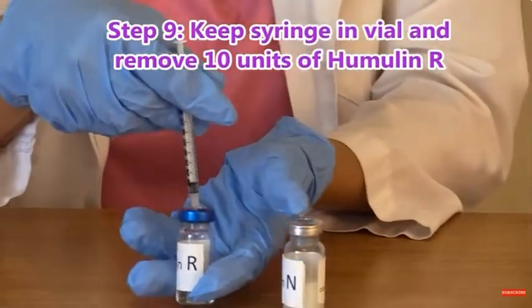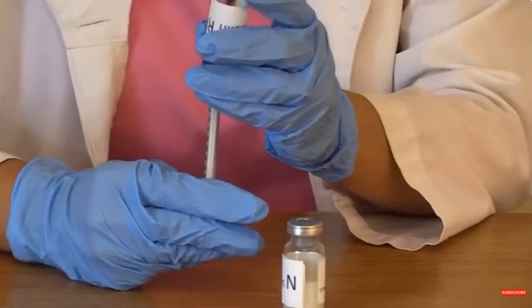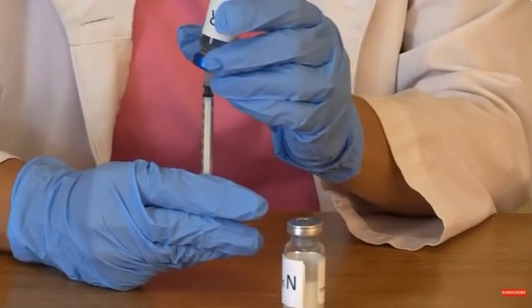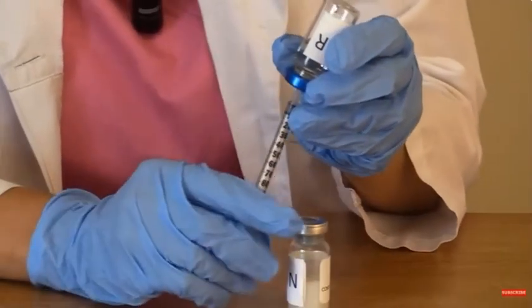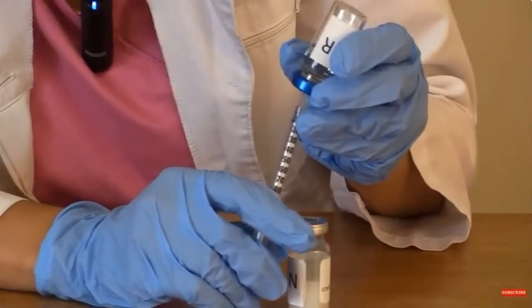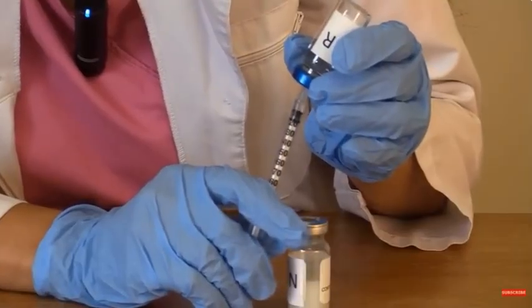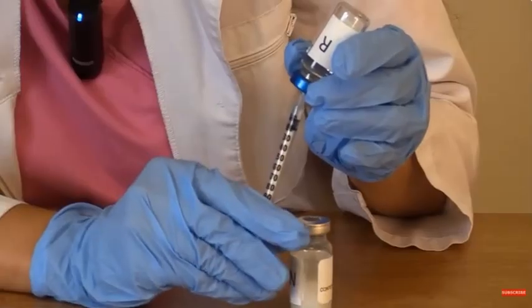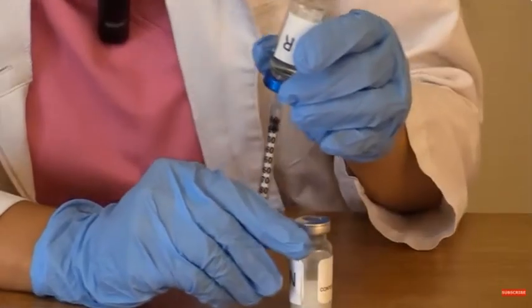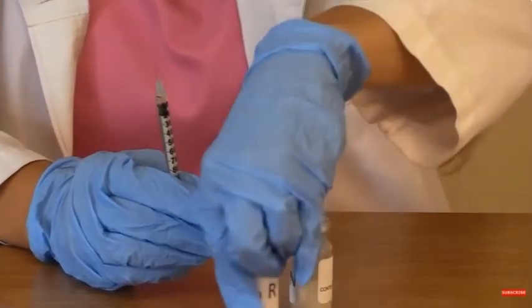Instead, we're going to take the bottle and flip it upside down, and remove 10 units of regular insulin. Watch on your syringe where 10 units is and make sure it's precise. And once you have that 10 units, you're going to remove the vial.